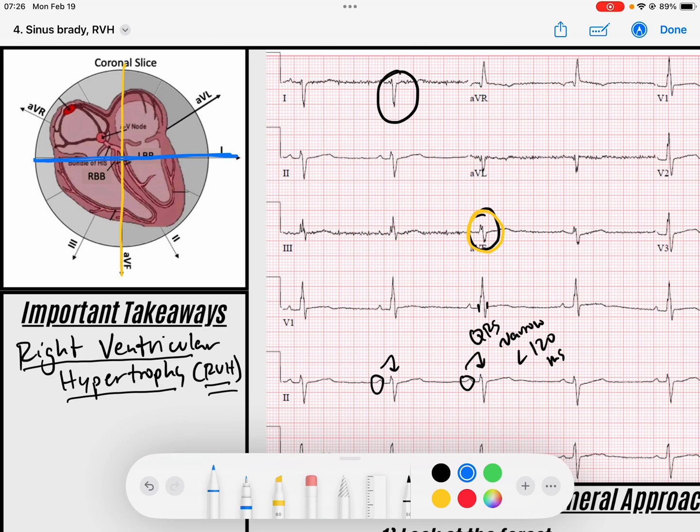If AVF is up and down and we have an isoelectric AVF, that means my signal is going perpendicular - isoelectric means perpendicular. My signal is going perpendicular to AVF along this axis. But we need to determine which way it's going. It's going negatively in lead one, so it's going this direction. That means my axis is like 180 degrees. We definitely have right axis deviation.